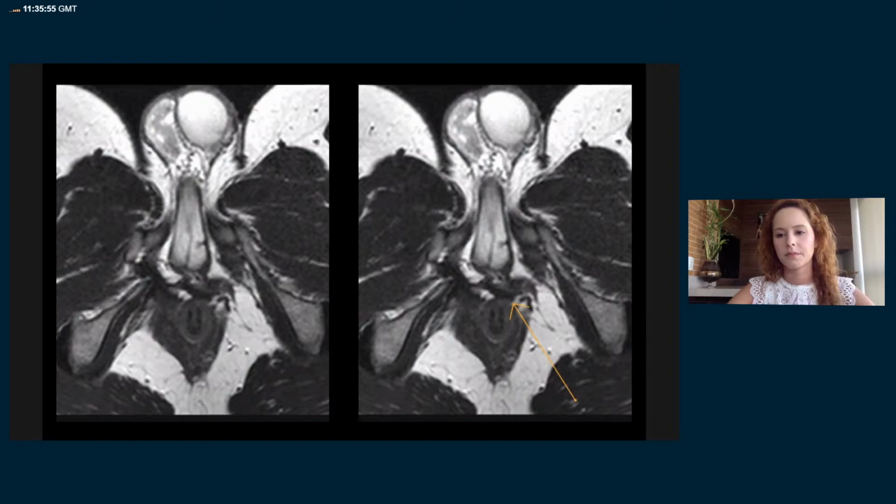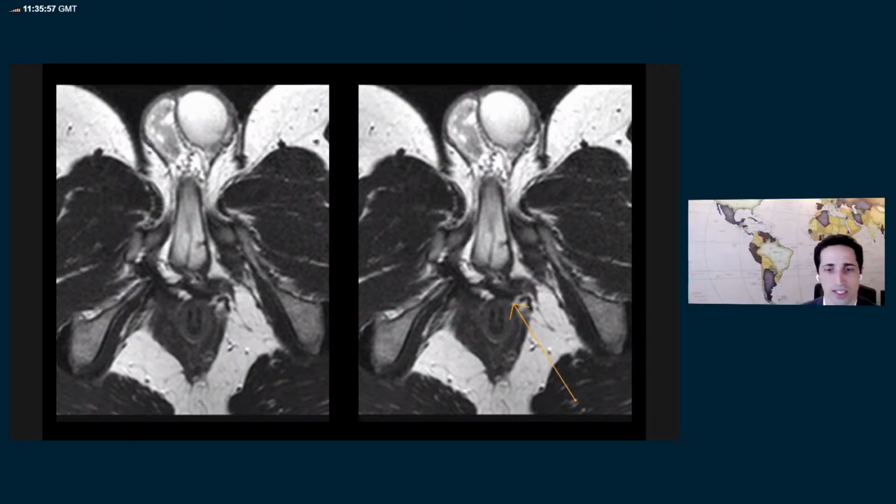The last one, okay. So the conclusion is that in the point of urethral stenosis, we have a lot of fibrotic tissue, not only spongial fibrosis, but fibrotic tissue in the periphery of the bulbar and membranous portion of urethra, and besides the penile strictures also. I think it's all for this image, Marina.